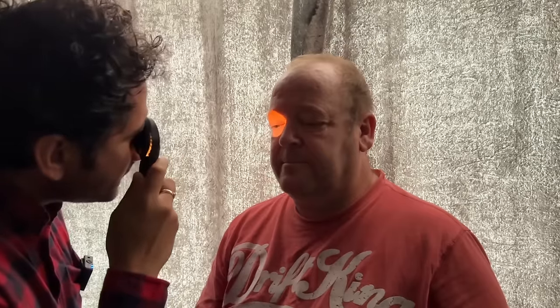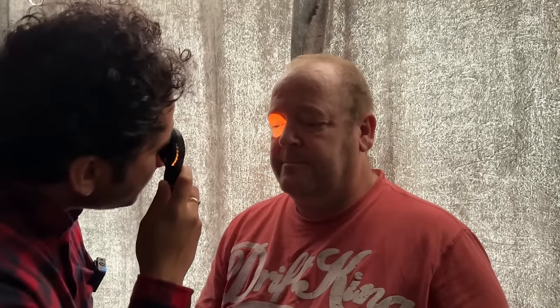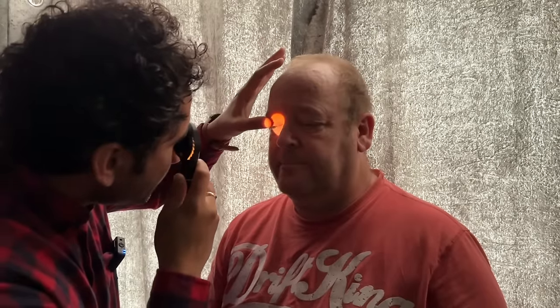Looking off into the distance, just remove your spectacles. We're going to start off at this distance, just finding the red reflex from the retina. From this distance you can observe any potential problems with the crystalline lens, and it might be possible to see some vitreous opacities. Now we're going to come in closer. Just look down for me now, and we're going to focus our attentions initially close up on the lids and lashes, checking for any lumps or bumps or lesions.